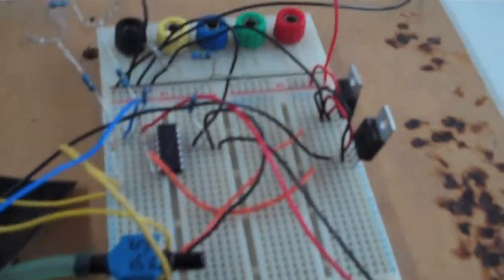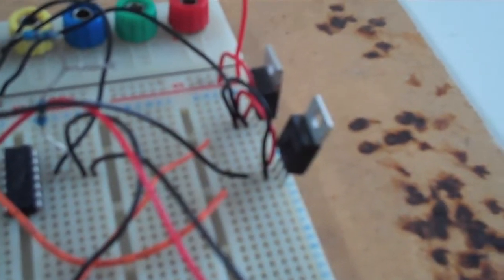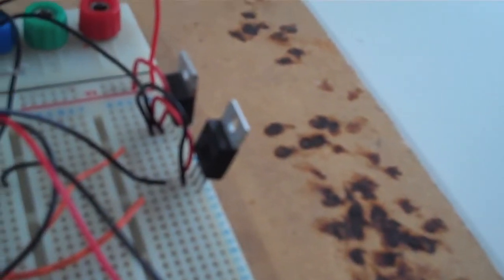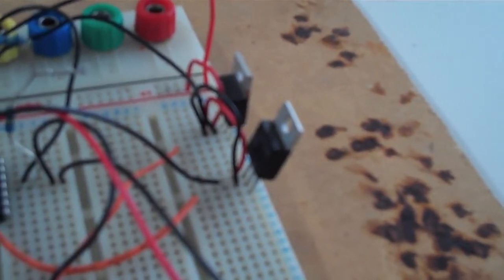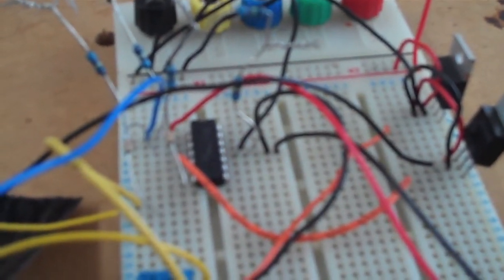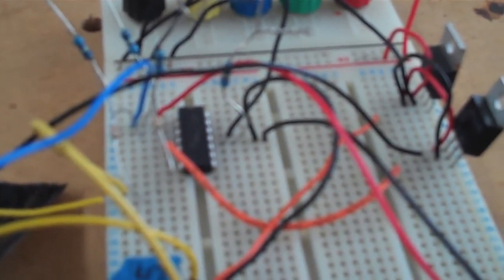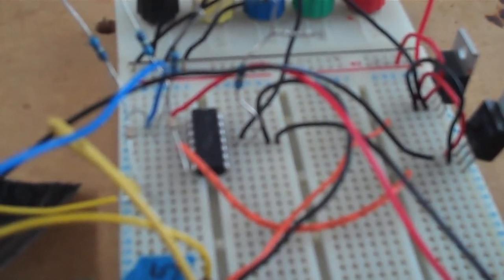This is the breadboard. We have 2 voltage regulators, one 5 volt regulator which is powering the op amp, and a 10 volt regulator which is supplying the 10 volts needed to excite the differential pressure sensor. The op amp is in a kind of differential mode, so it's monitoring the difference between 2 voltage inputs, which are the 2 voltage outputs from the pressure differential sensor.